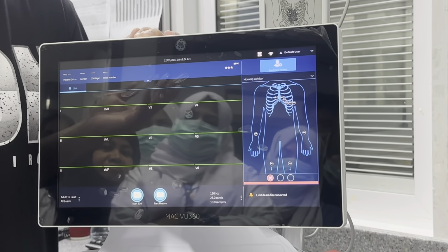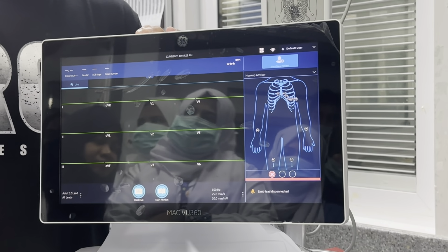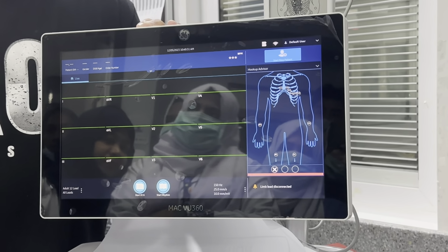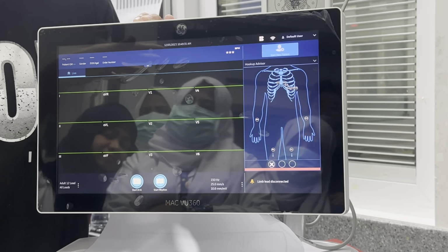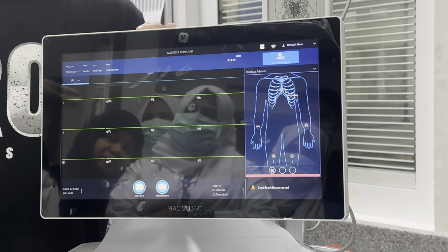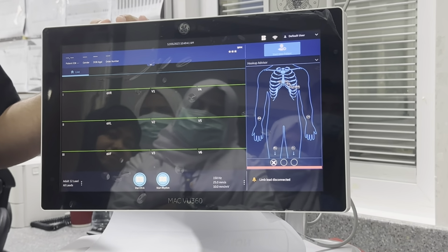What does auto ECG mean? It means upon hooking up your patient, the machine will detect the best 10-second signals coming from the patient side and acquire the ECG automatically for you. But it will leave the decision for you to accept or reject. Okay? And I will show you how well it runs here with the simulator.